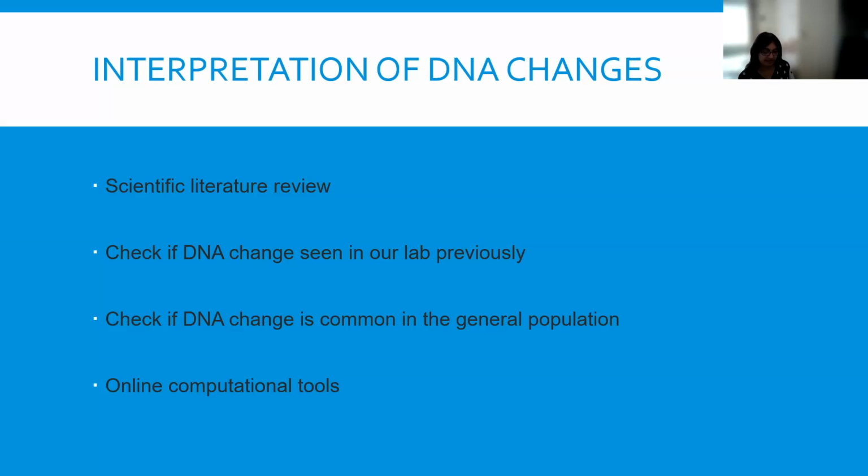For example, scientific literature searches, and review for gene variants associated with channel disease. Checking our own lab data, checking if the DNA change is common in the general population or not, and using online DNA analysis computational tools.